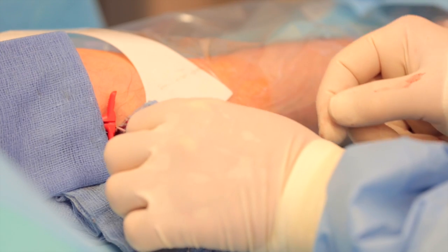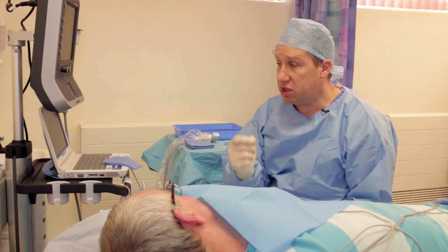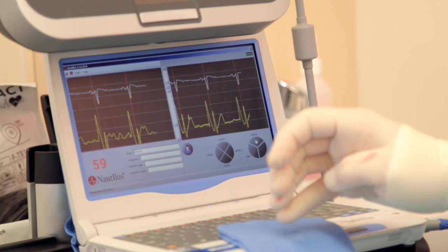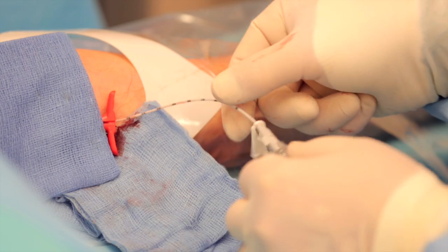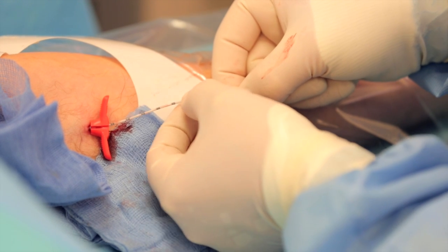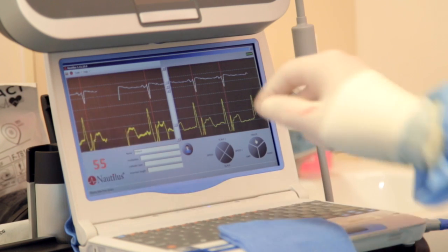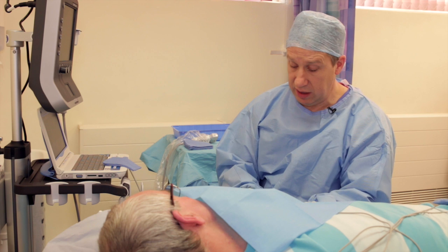Threading the line in again, looking for maximum P without any negative deflection. A large P wave without negative deflection is achieved — this is the preferred position at the cavo-atrial junction. Freezing to confirm: the line is at the 50 centimetre mark at the skin. The stiffening wire is then removed from the PICC line and a clip is placed to stop backbleeding.